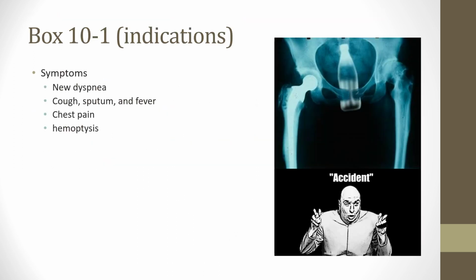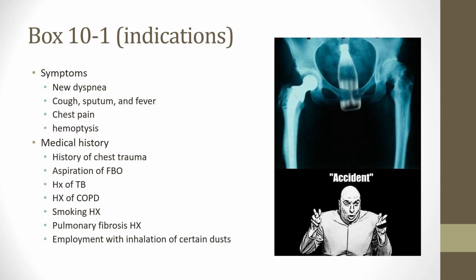Alright, indications, of course, new onset of dyspnea, cough, sputum, fever, chest pain, coughing up blood. Those would be indications for an x-ray, of course. Other things, too, if someone has a history of chest trauma, we want to see if there's broken bone.